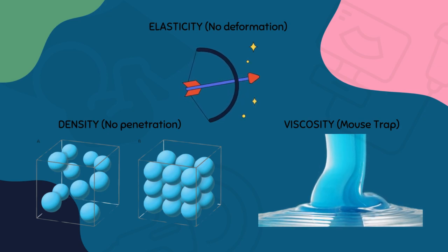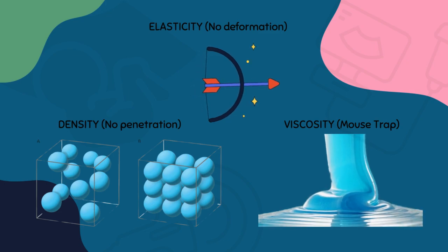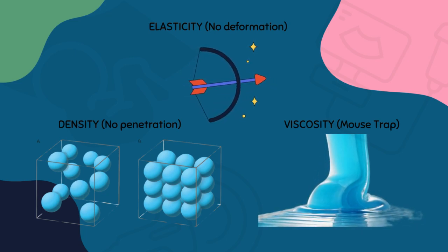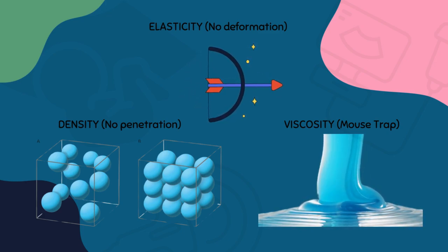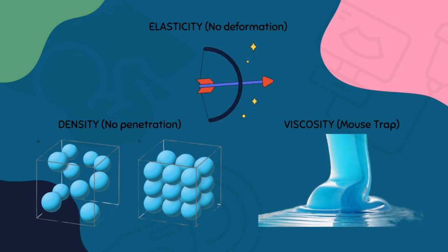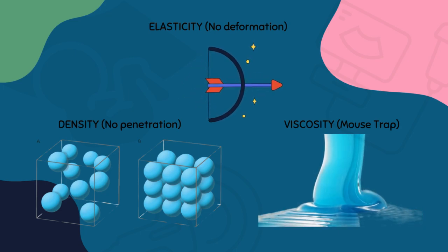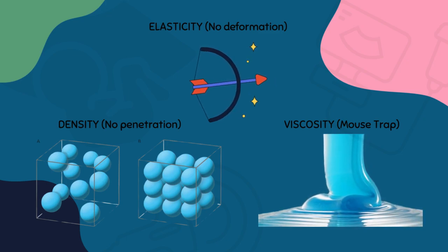Secondly, an elastic or stiff structure has the ability to resist deformation. It will push back sound waves in another direction due to its elastic nature. A better way to imagine this is to picture the knock and the fletcher of an arrow as it is applied on the string of a bow. The elastic string will push the arrow back in the opposite direction that the initial force was applied.